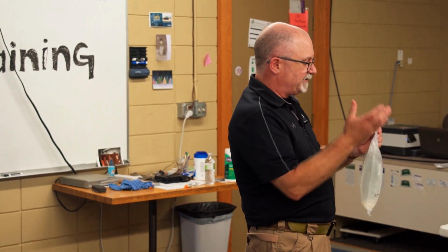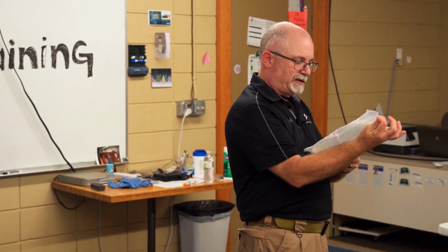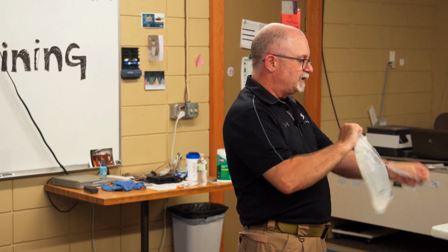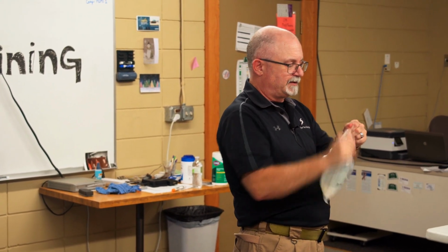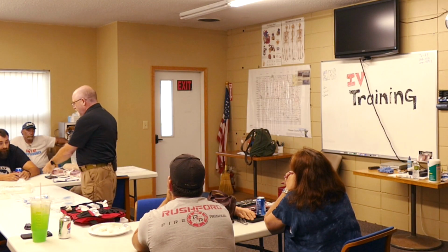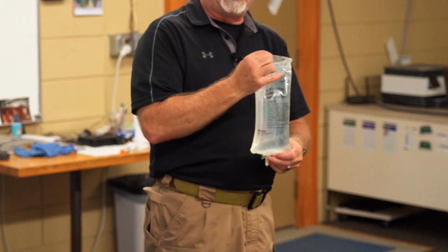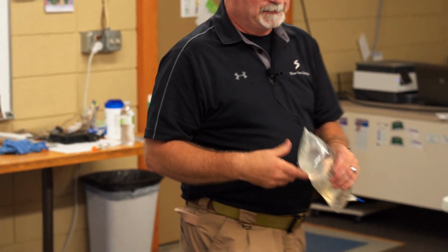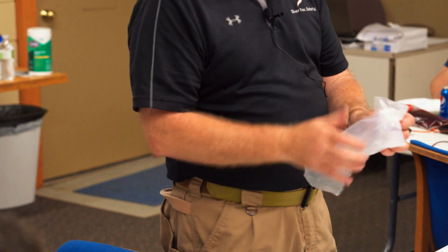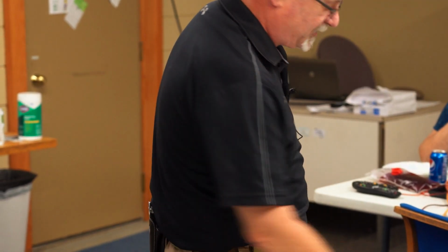The outer package is simply a protective mechanism during shipping, storage and handling, but they're pre-scored so you can tear them open. I'm going to tear into this one. It's also a nice improvised occlusive dressing if you need it. You guys are using a commercially produced one, the HyFin or whatever. But if you really do have a penetrating trauma, this is really good heavy gauge, and you tape three sides, bottom, you know, you guys all know that.